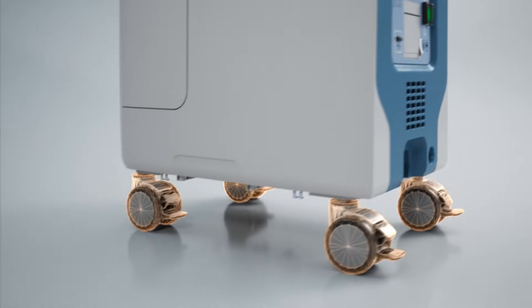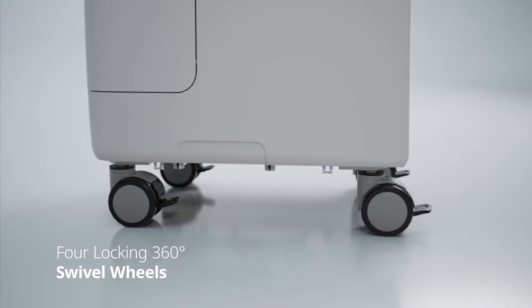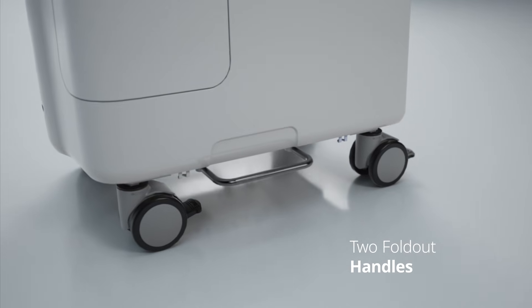Built for on-the-go maneuverability, its four locking, 360-degree swivel wheels enable smooth and reliable handling on uneven terrain. And two fold-out handles provide access for lifting and secure placement during transport.